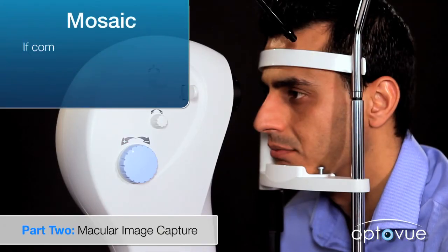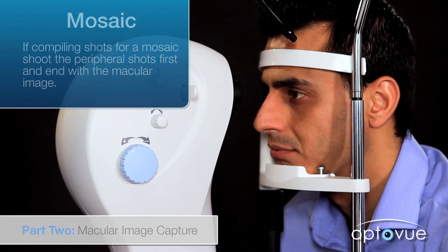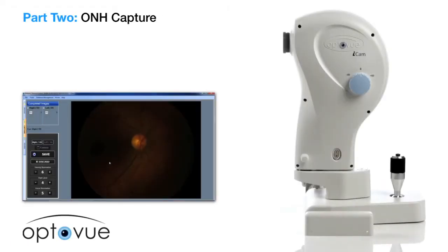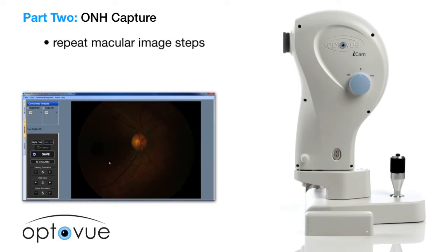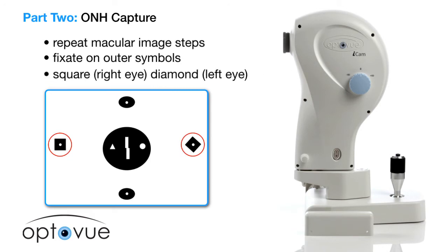Note on mosaic: if compiling shots for a mosaic, shoot the peripheral shots first and end with the macular image. Optic nerve head capture — the following demonstrates how to capture optic nerve images. Repeat the steps listed previously for macular images, but have the patient fixate on the outer symbols: square for the right eye and diamond for the left.